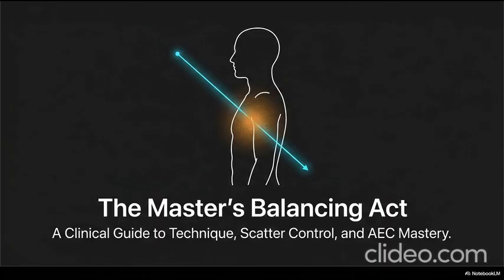No, you really can't. And looking at these chapters, the complication doesn't even stop at the console settings. The actual geometry of the room plays a critical role. Oh, absolutely. Distance is huge. Right, specifically the SID, the source to image receptor distance. Moving the X-ray tube closer to or farther from the patient drastically alters the exposure intensity. Yes, and this is governed by the inverse square law.